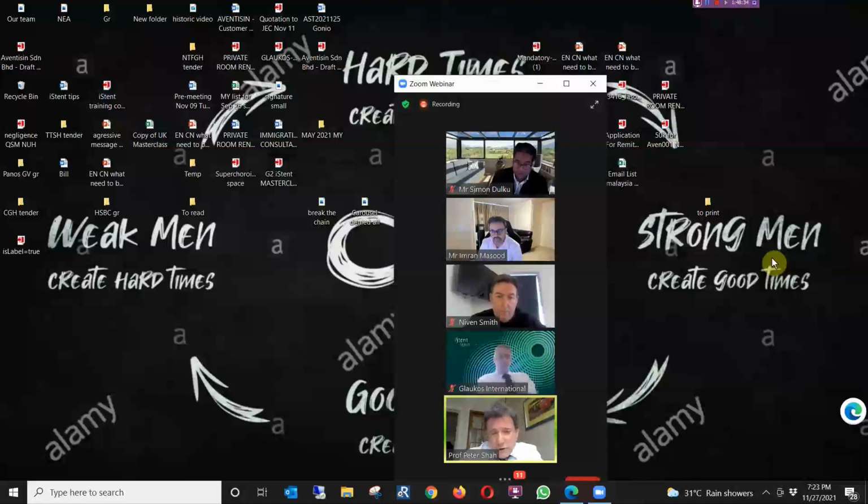So what kind of pearl can I give you? Well, first of all, I stop all prostaglandin analogues at the time of surgery and keep patients off them for 8 weeks post-op before restarting them. There's very good evidence that the blood aqueous barrier after phaco surgery is broken down for a lot longer than we think clinically. And for all those eyes with suboptimal blood aqueous barriers, that's everything from angle closure, pigment dispersion, pseudoexfoliation, uveitis, severe OSD, other secondary glaucomas, maculas with ERMs, VMT, systemic diabetes, COPD, ethnicity, African, Caribbean, Indian, Asian.